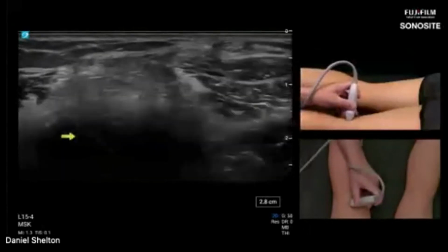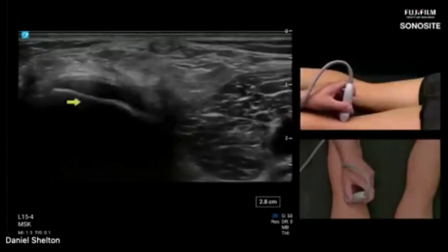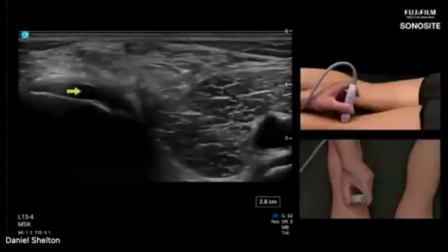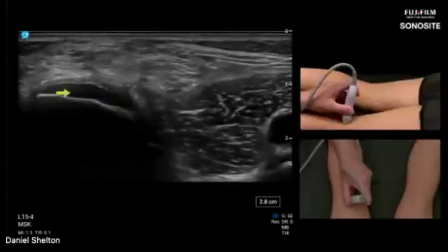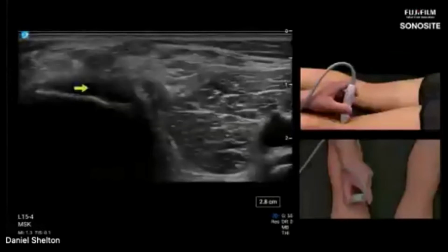So let's find out which one that is. As I went proximally, I know that it's probably the femur, but let's just double check our work. So here's the cortex of what I think is the medial femoral condyle. Now, the medial femoral condyle has that big articular hyaline cartilage cap, and our patient's young, so plenty of tread on the tire here. So plenty of cartilage, nice and parallel right over the condyle. And then I'm going to go chase that other bone down.